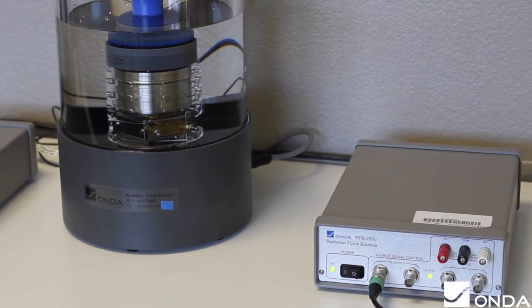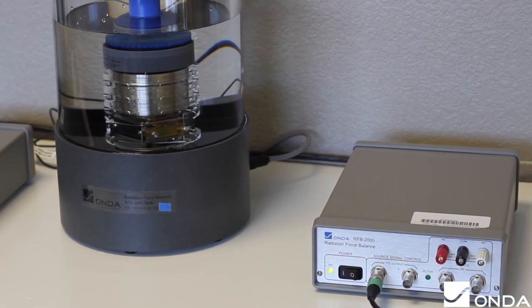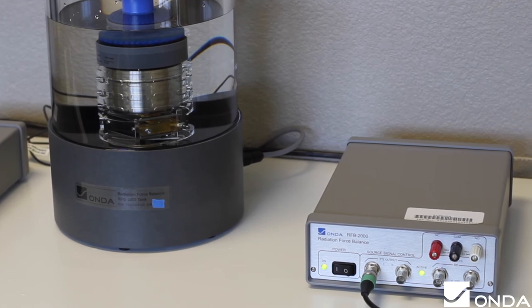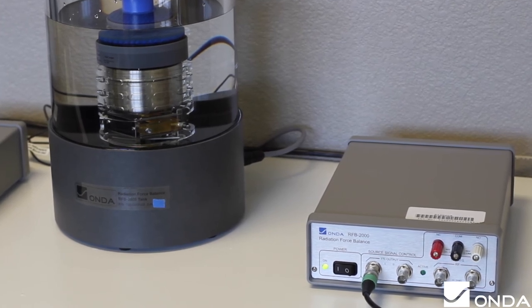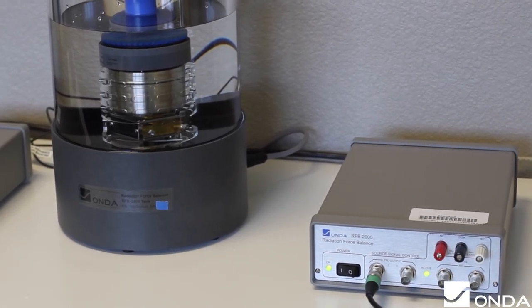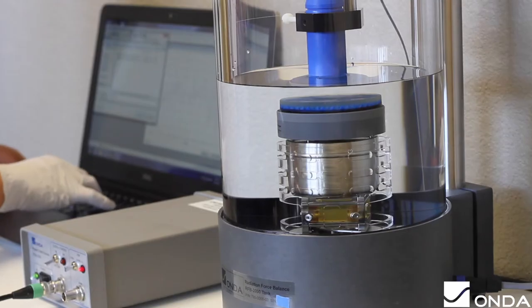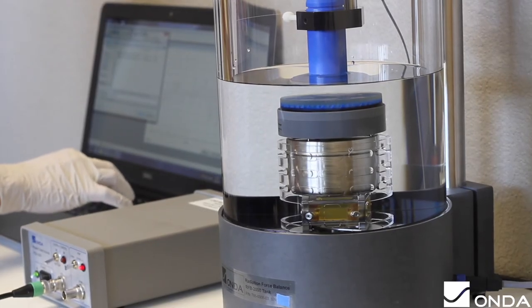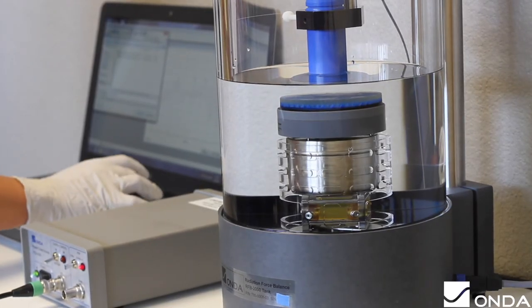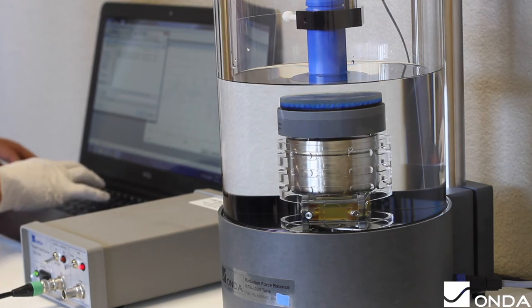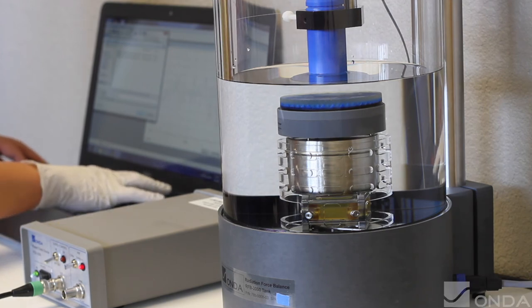The RFB-2000 is visually transparent for easy monitoring of the test transducer, making it easy to set up and use. The system provides convenient support for transducer mounting and requires no special membranes or acoustic gel. We recommend changing the water as often as daily and having the RFB professionally calibrated every two years.